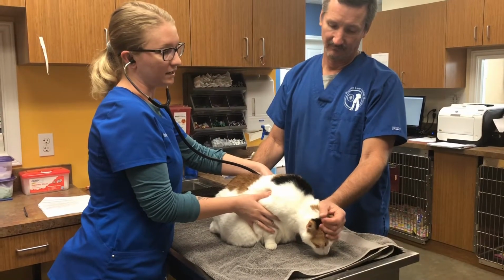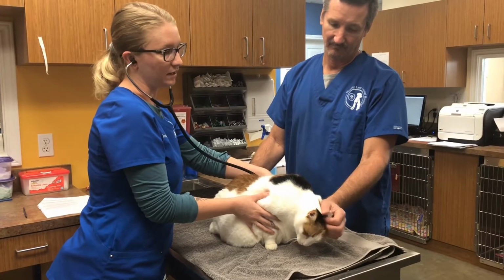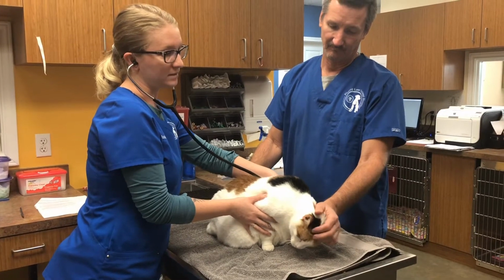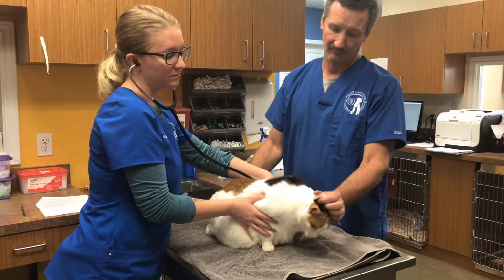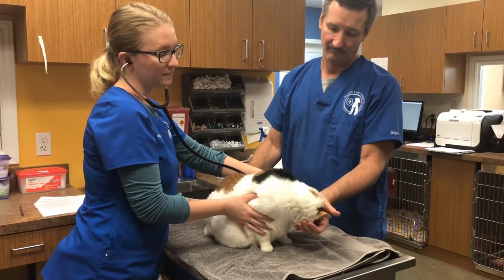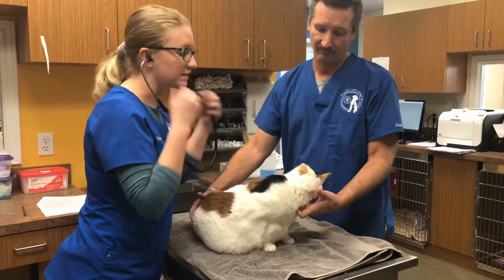You want to listen for any wheezing, crackling, popping sounds that could indicate pleural effusion or fluid. But everything sounds clear there.